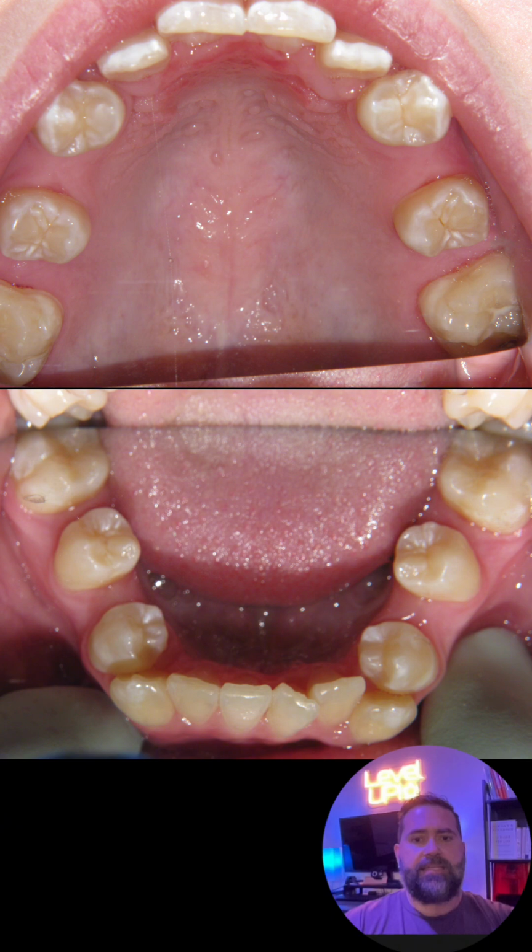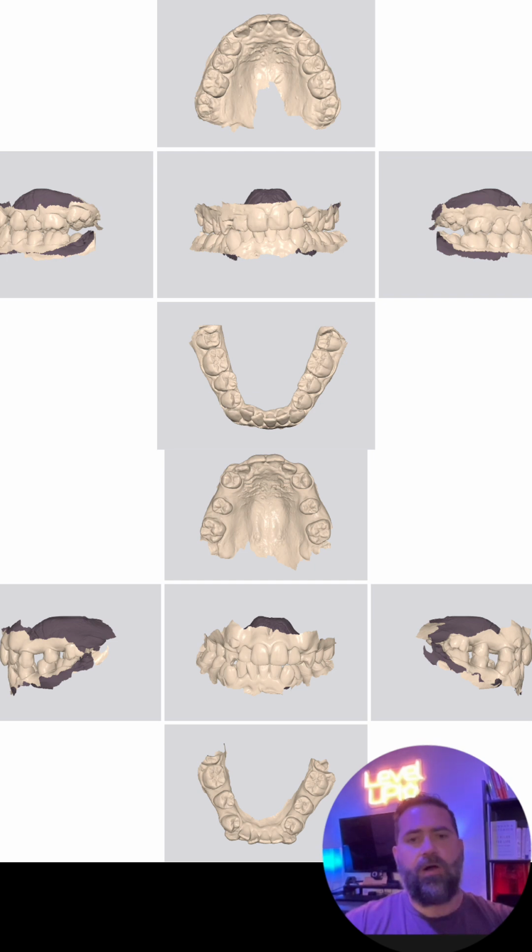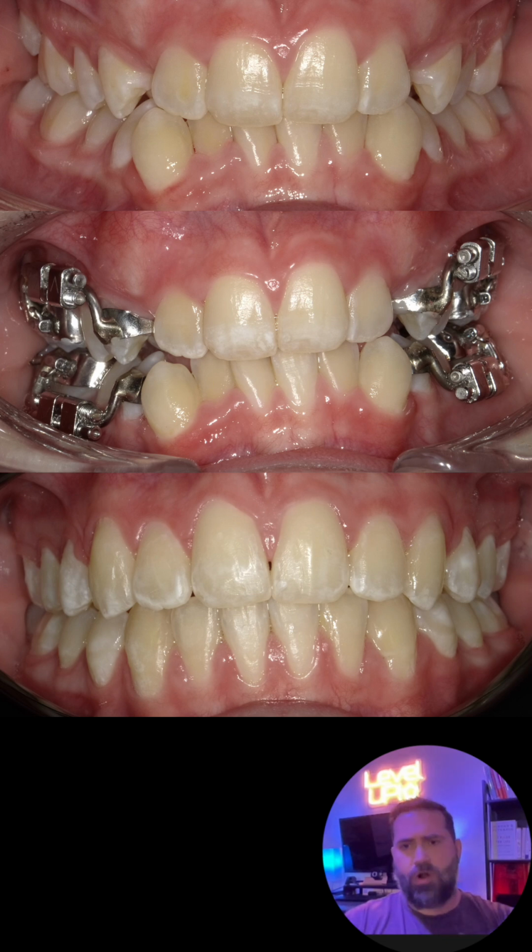So there is the upper and lower. Here is overjet. I'm taking it with a Panadent ruler. On top is the day of the delivery, and then the bottom is the day right before removal, and you can see minimal change. Here are models of pre-op and post-distalization. And then here's everything start to finish.